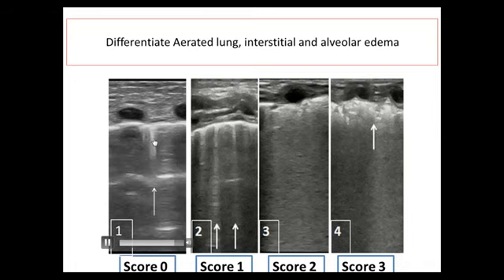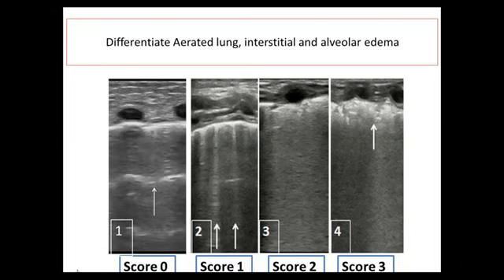Lung ultrasound severity score has been published in adults as well as in some neonatal literature. So we can consider 3 lung severities plus the normal lung. So the normal lung will be given a score of 0, or pattern number 1, when you have well demarcated pleura, dominant A lines and just minimal B lines not reaching the bottom. So that's a score of 0.